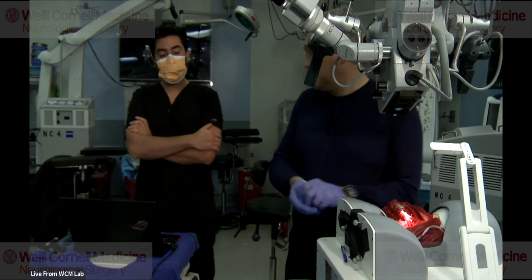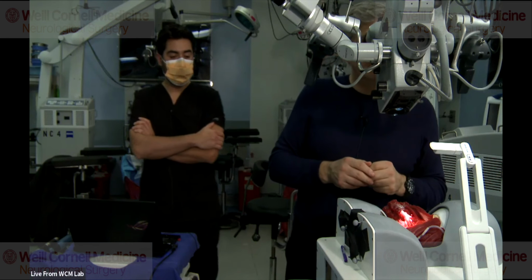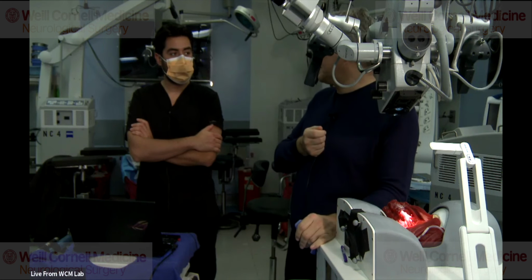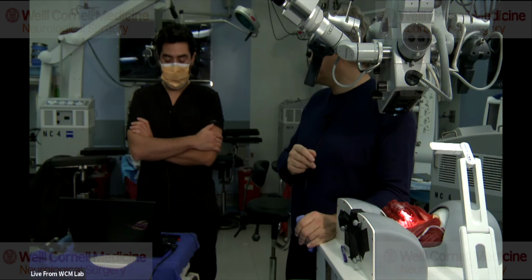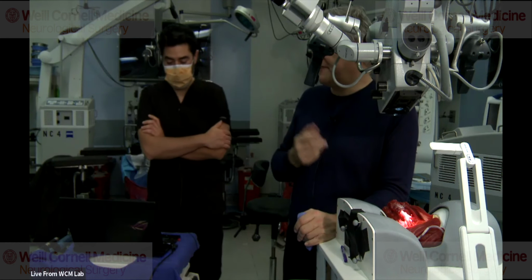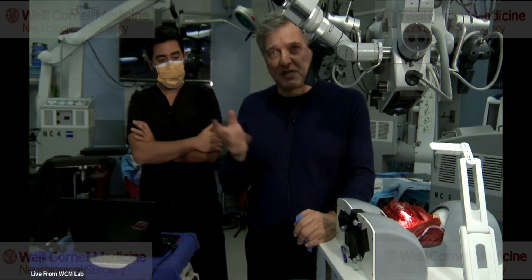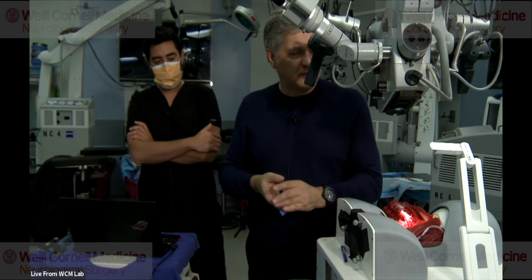Do you leave anything in the defect after you finish? Gel foam or steroids? Yes, I use steroids. I put a little bit of steroids. I get really nice hemostasis. I pull out the retractor a little bit, get hemostasis, and then deliver the steroids so they're not getting diluted, if possible. Then we take the tubular retractor out, close the fascia, inject Marcaine into the muscle, and close with a subcuticular closure for the skin. Those patients all go home the same day, pretty much.